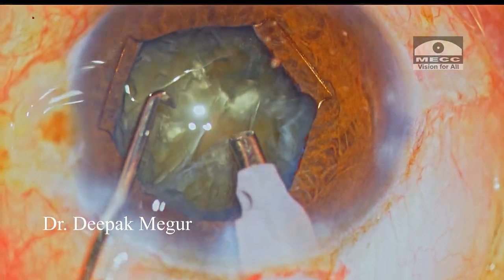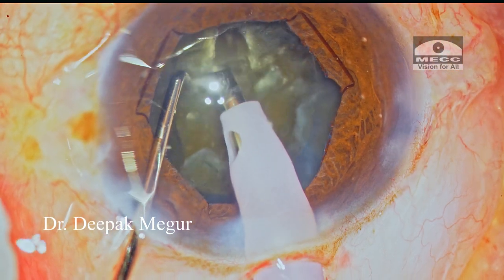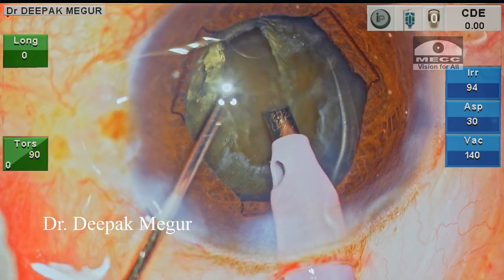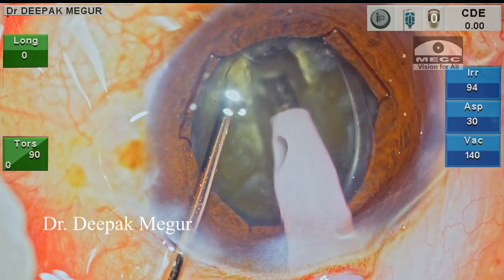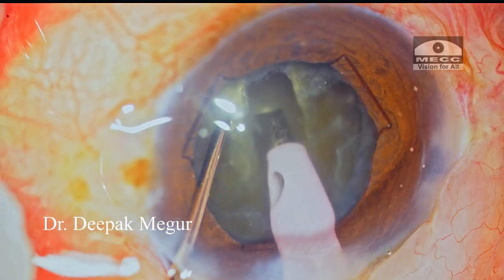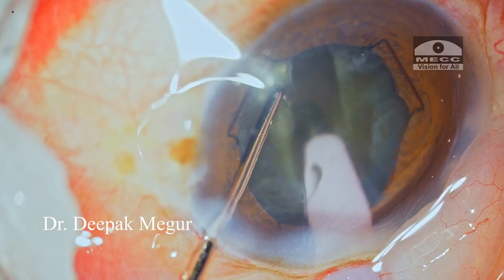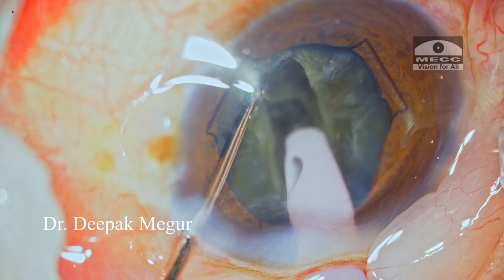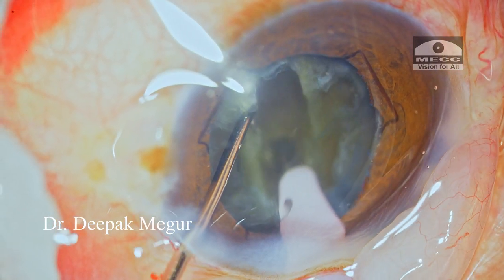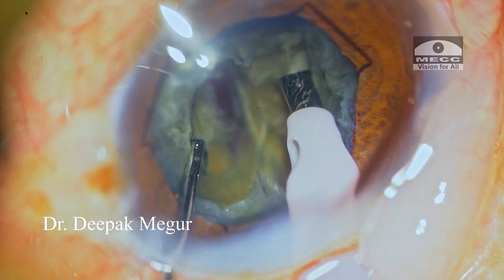Now is the time to manage the nucleus. My plan is to divide it into multiple fragments and then consume them using the stop and chop technique. During sculpting, I'm supporting the nucleus with my chopper — this helps as the bag is mobile. Supporting the nucleus is an important tip when dealing with eyes with mobile bags. I chose stop and chop because it gives extra space within the bag, minimizing stress transmitted to the zonules. It's important to create a deep trench to enable easier division of the nucleus into two halves without stressing the zonules.